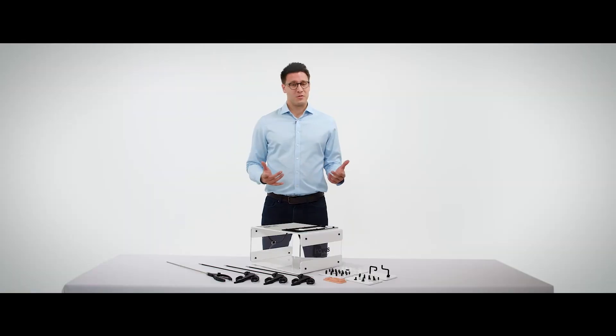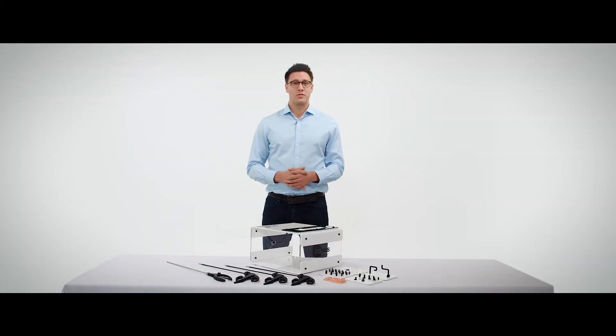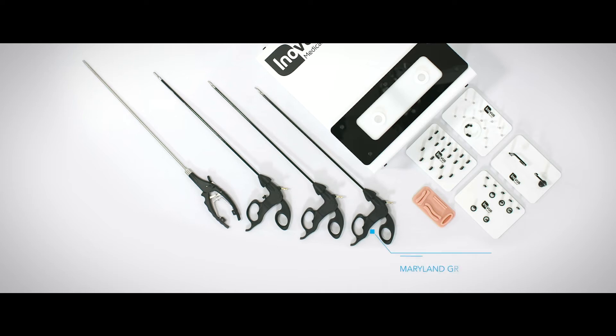The simulator also comes as standard with a suturing base, as you can see here in the front of the simulator, and it also comes with four instruments. These include a laparoscopic Maryland grasping forcep, laparoscopic Johan's forcep, laparoscopic scissors, and of course a laparoscopic needle holder.